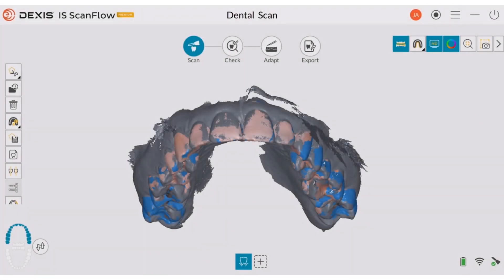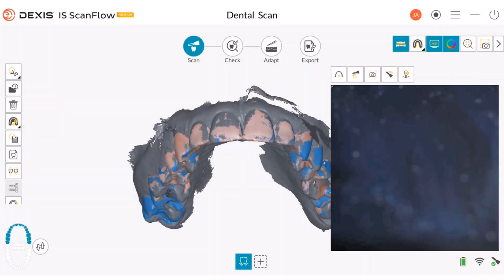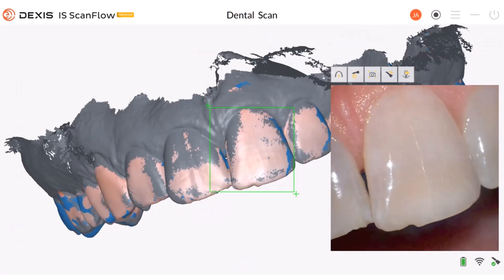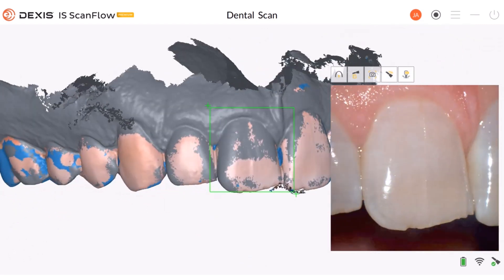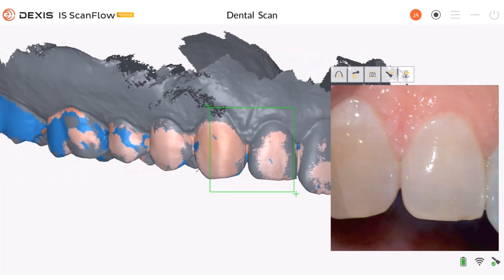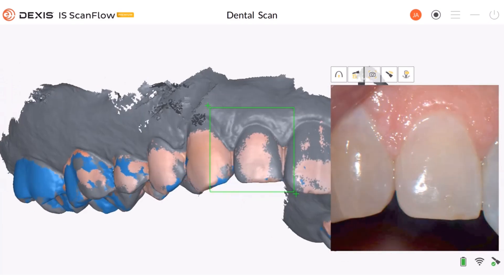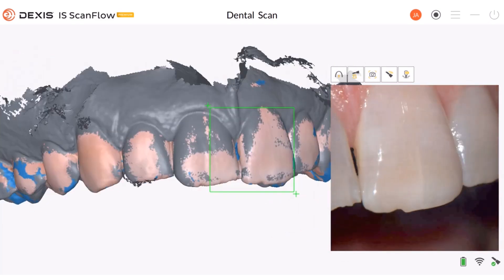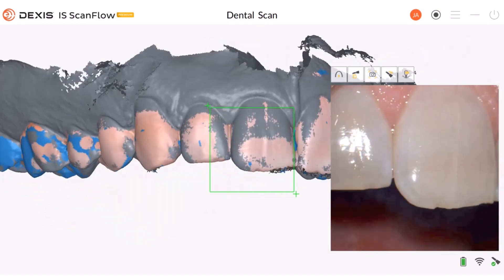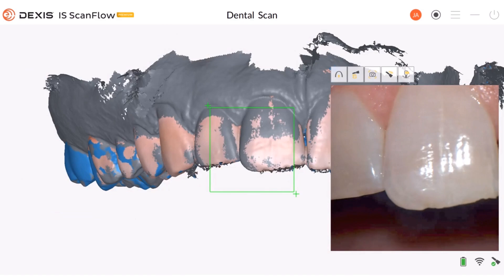To acquire images using the Central Area Check tool, follow these steps. Scan the teeth as you normally would, using the techniques described in the common scan. As you scan the areas on the teeth needing shade information, they are highlighted in blue. The soft tissue is highlighted in grey. Scan these areas to capture the shade information and remove the blue highlights.